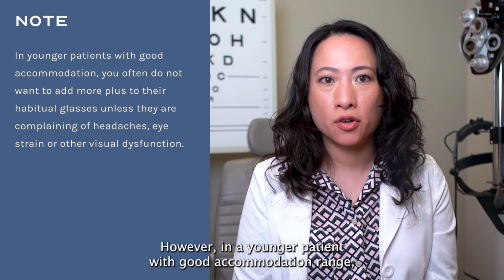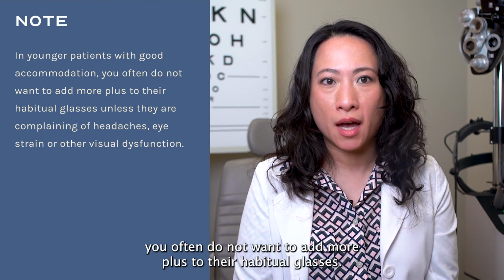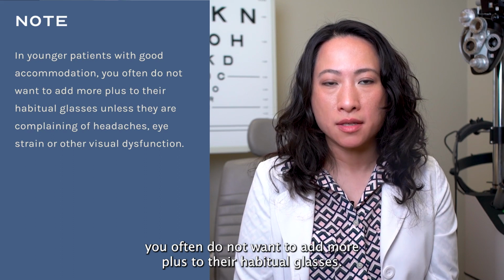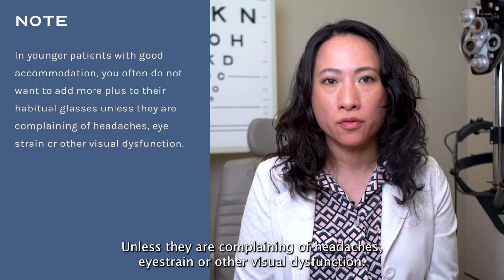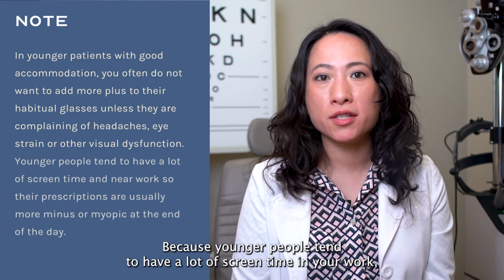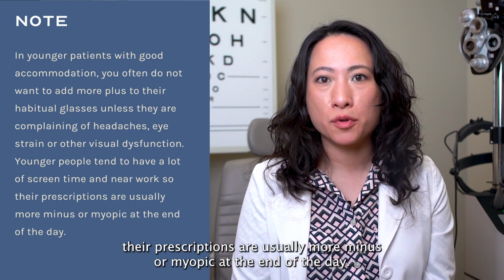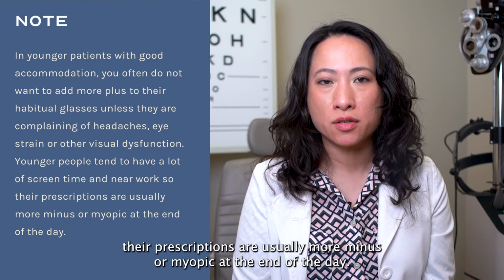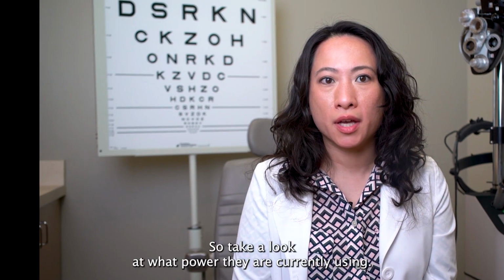However, in a younger patient with good accommodation range, you often do not want to add more plus to their habitual glasses, unless they are complaining of headaches, eye strain, or other visual dysfunction. Because younger people tend to have a lot of screen time and near work, their prescriptions are usually more minused or myopic at the end of the day. So take a look at what power they are currently using.